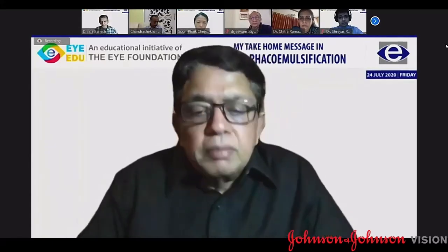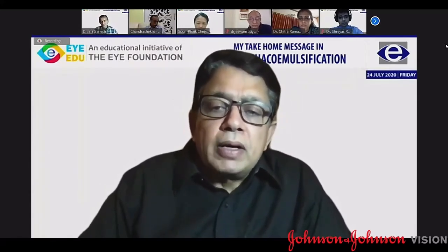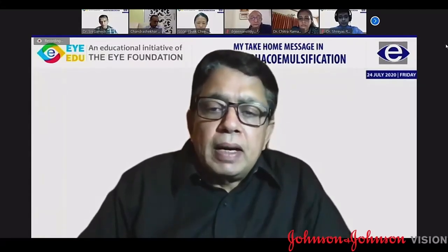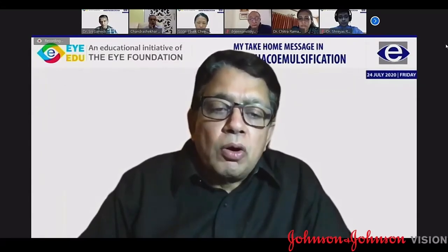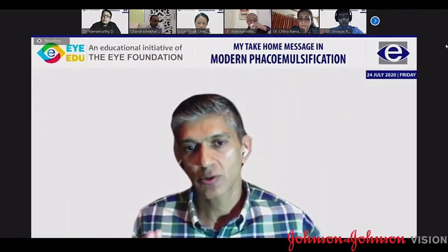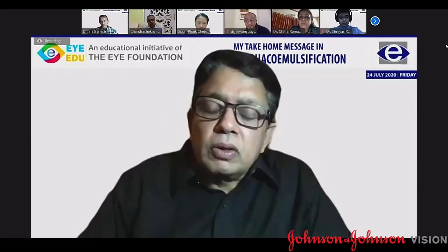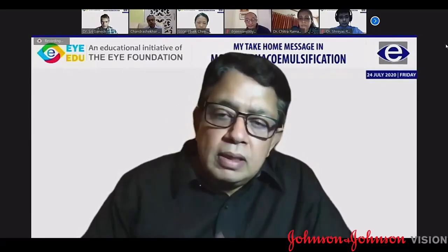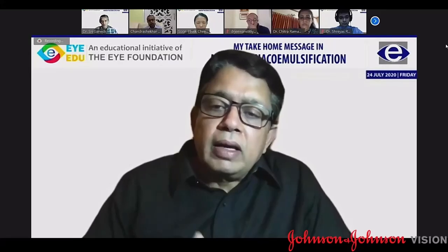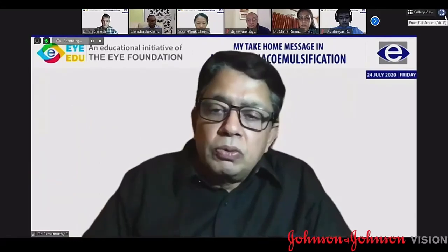All very valid comments. I think most of us, as Professor Chi also mentioned, have shifted over to the Barrett suite almost completely for all our biometry calculations. Anyone in the panel or among the speakers who's sticking to some other formula? See, I like to do a Barrett toric calculation for all patients. What I was trying to say was, we use the Barrett Universal for normal eyes, the Barrett Toric Calculator for toric lenses, and Barrett True K for post-refractive eyes. Like that, we have shifted almost completely to the Barrett suite.